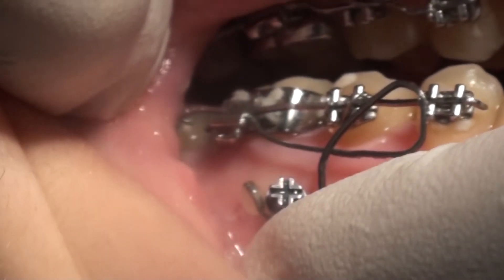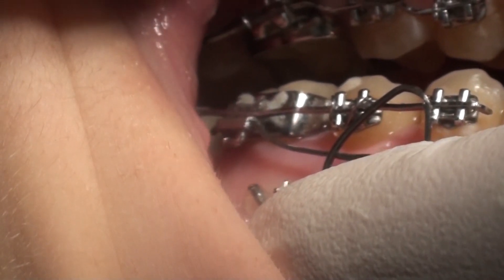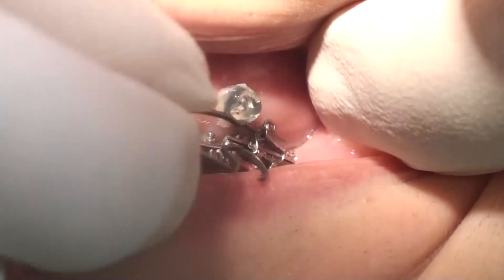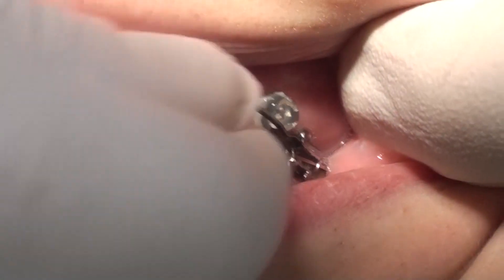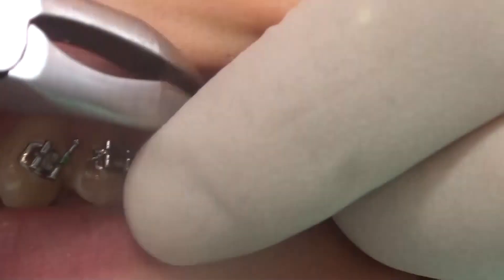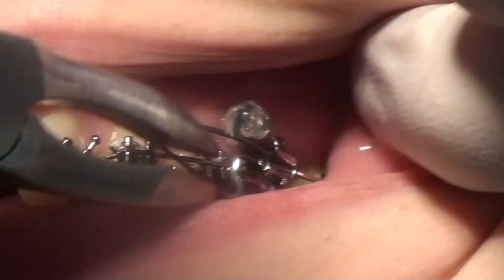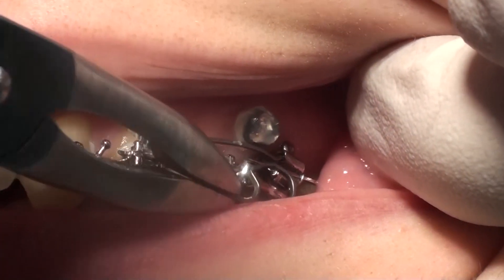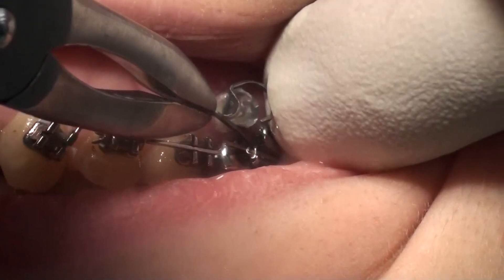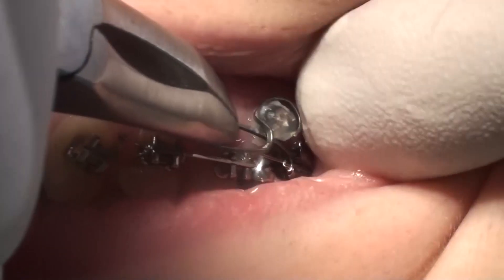This is the shape of the cantilever once it is activated and hooked to the TAD. Here we have the other side — upper left — same system. The wire is engaged into the auxiliary tube and we are now activating and hooking the cantilever.